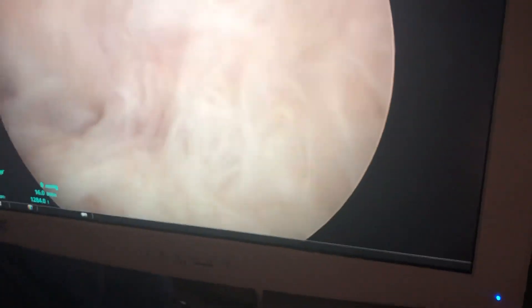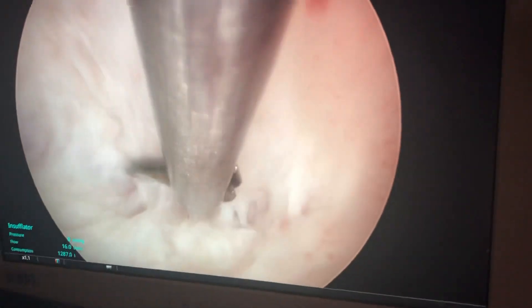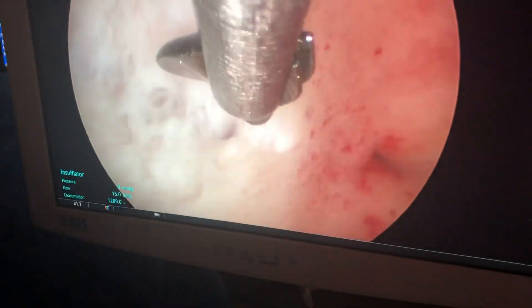You can see it's still not bleeding at all, and we're starting to see some little blood vessels right there, telling us we're almost done. There's the pink underneath. We're continuing to cut this white fibrous tissue — not bleeding. Now we knew she had a septum, or truly suspected she had a septum, from her ultrasounds in the office. And here we're just simply confirming what we were pretty certain of.